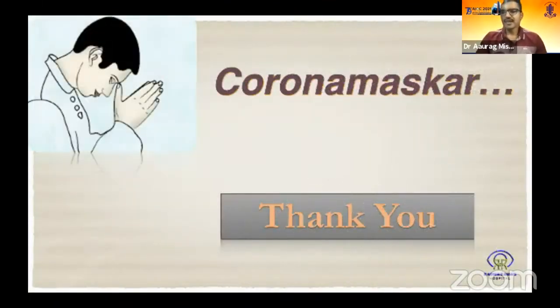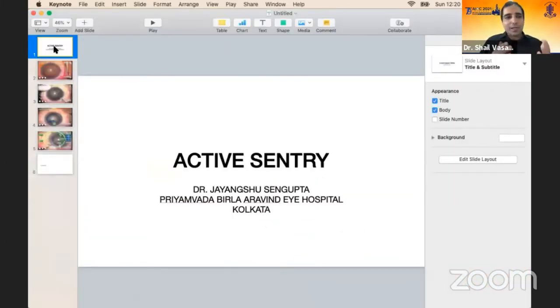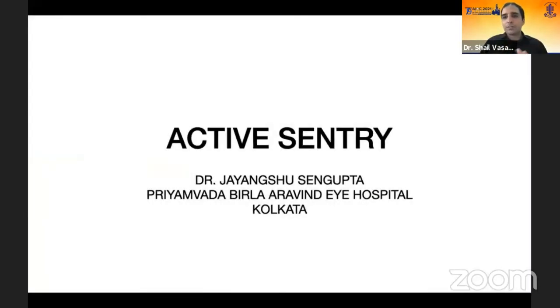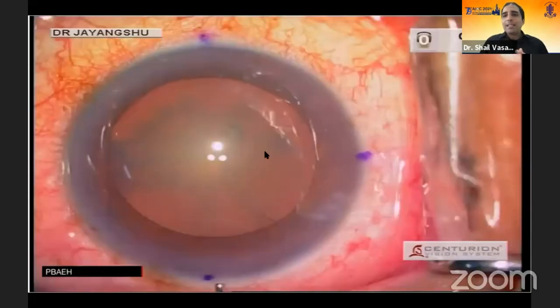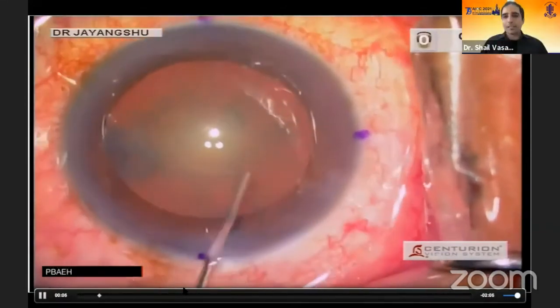Thank you for those excellent videos. What I find most striking with the new balanced tip compared to the previous tip is the tremendous improvement in efficiency during lens removal. We previously had to use 80, 90, or 100% Ozil very often, but now we hardly need to go beyond 60 or 70%. The CDE drops by at least 30 to 35%, which is one of the major stark differences from changing the tip, due to the robust increase in stroke length.